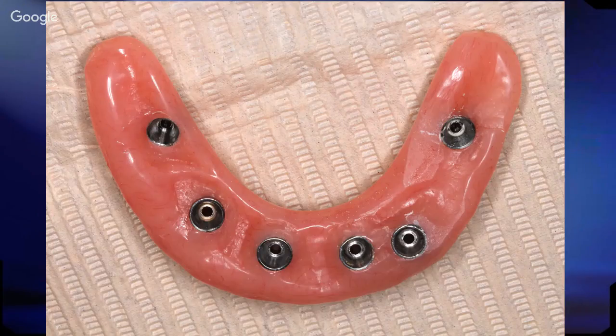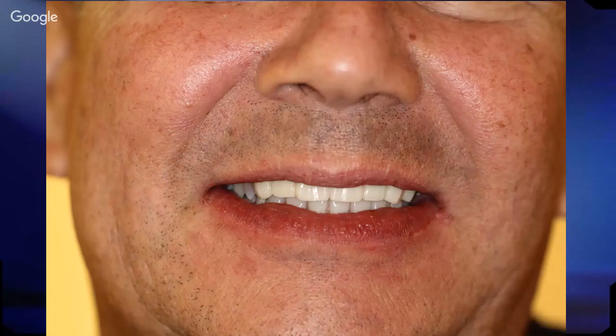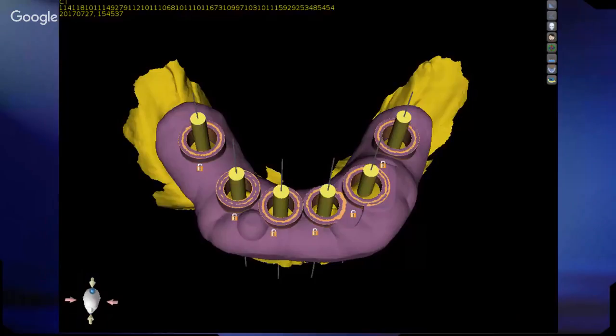This is the intaglio surface. You can see our copings are processed nicely, and the patient goes home with a fixed restoration same day. Okay, so that's called a sequential guide, and we've used that numerous times to do same day cases. And again, low cost because we're doing it in the office. I think the total cost of the export from Blue Sky and to make the two guides was certainly less than $100 with all the sleeves and such. So a low cost way of doing an all-on-X case, same day in your office.